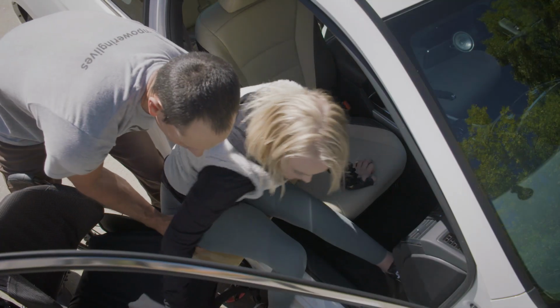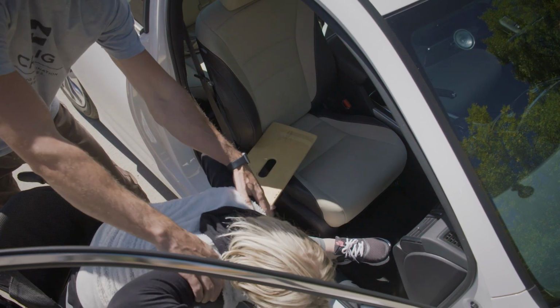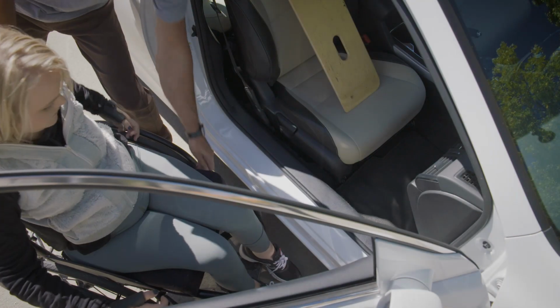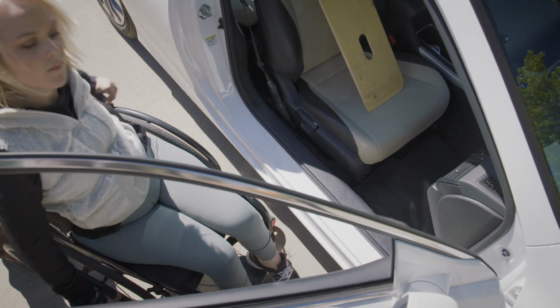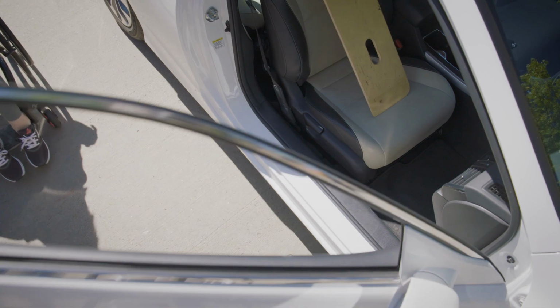During the transfer, the hips slide first as the head is kept down until the pelvis and hips are safely in the wheelchair. Once the passenger is secure in the wheelchair, unlock the brakes and move away from the car. When you have enough space, the passenger can properly position their feet on the footplate.